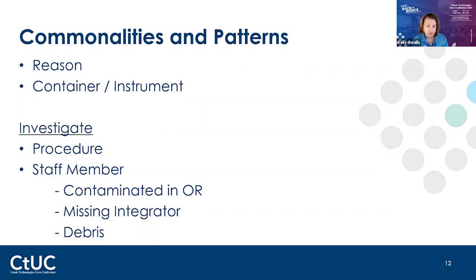If it's debris, if they're having to flash because of dirty instruments or finding things in a container, go to that container history. Who assembled this? Or sorry, who cleaned this? So who cleaned this? Who scanned it to decontam? Because if there's true stuff that, had it been a good pre-wash, it would have come off in the washer, then yes, some education is needed there.